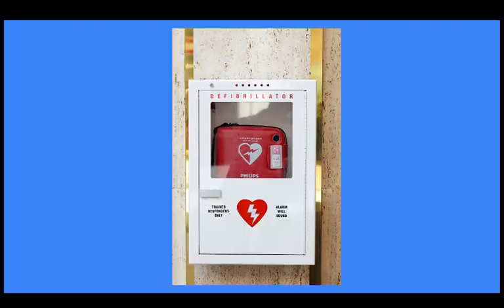An AED is a device that recognizes VFib and other dysrhythmias and delivers an electric shock at the right time. The AED has become a common sight in public buildings. The AED is nearly foolproof and will not allow you to make a mistake. It is safe for anyone to use.